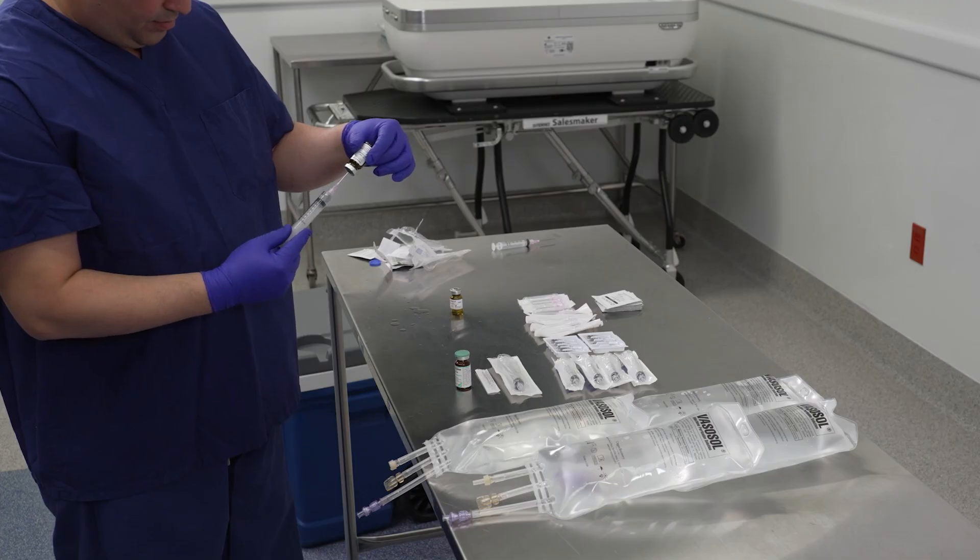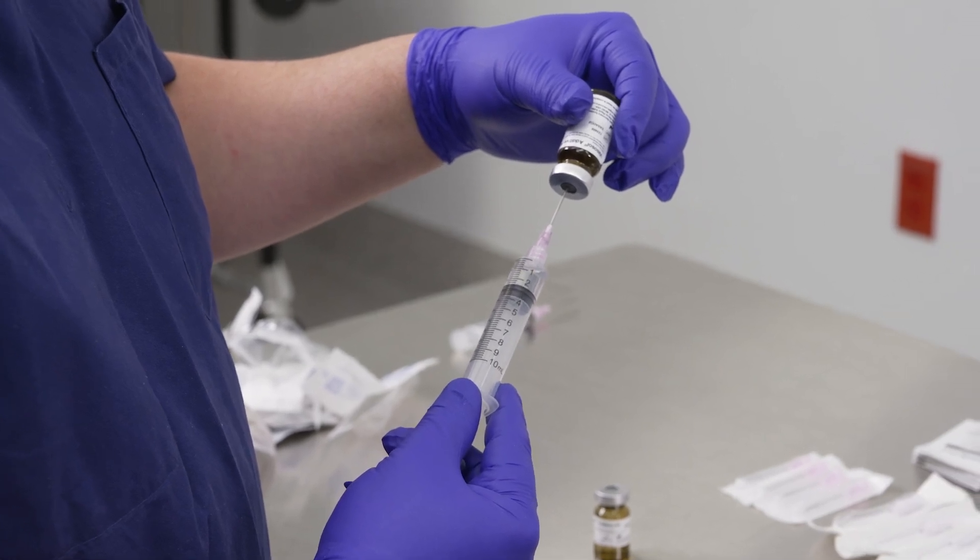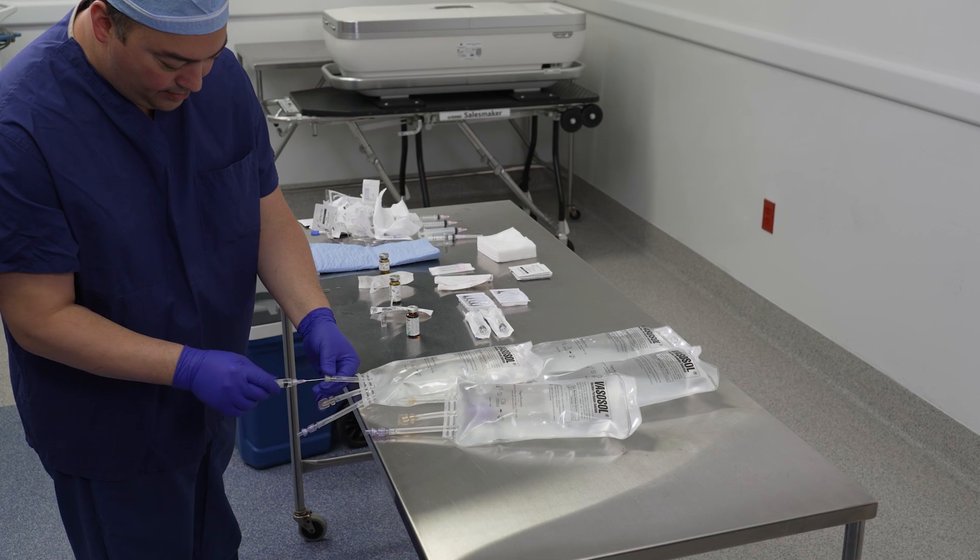Using a sterile syringe, draw up two milliliters of vasosol additive number two and inject it into the vasosol.